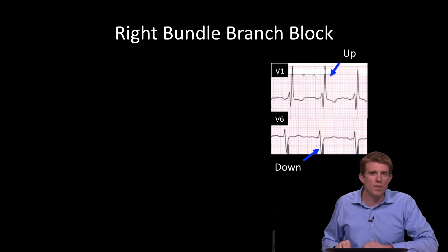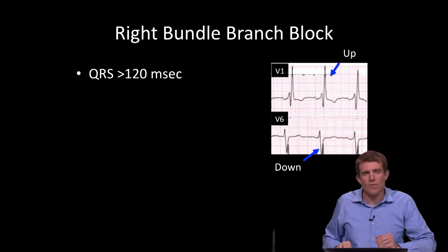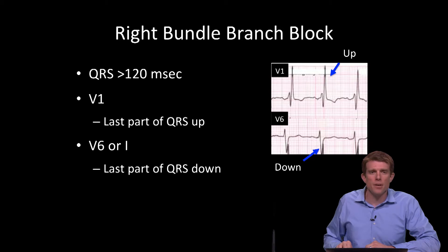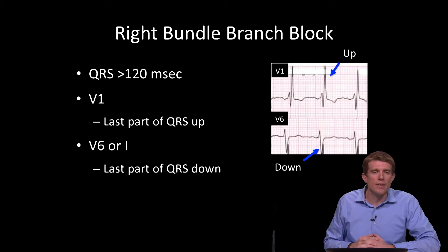So, up in V1 at the end of the QRS complex and down in V6. When we look for a right bundle branch pattern, we want to see that the QRS duration is greater than 120 milliseconds. If it's less, like 100 milliseconds, we're going to call it a nonspecific intraventricular conduction delay. We know that in V1 the last part is up, and in V6 the last part of the QRS is down. If you're not sure when you look at V6, you can also use lead 1 — the last part of the QRS should be down in lead 1 as well.